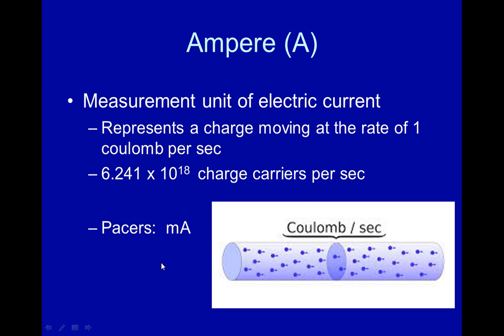And most of you recognize that when we talk about pacemakers, we're talking about much smaller amounts of current. And so instead of using the ampere, we typically use the milliampere.